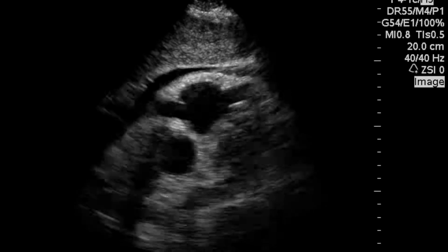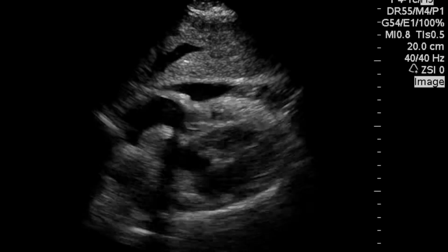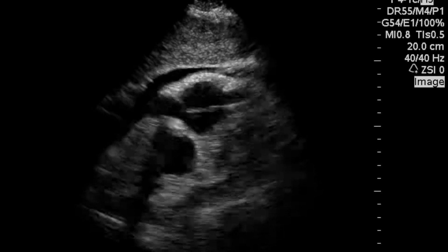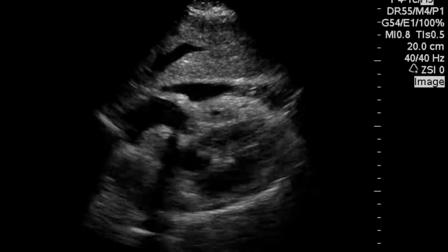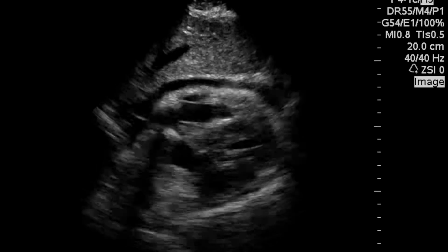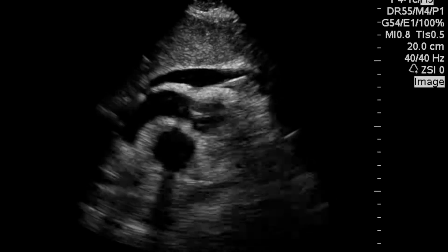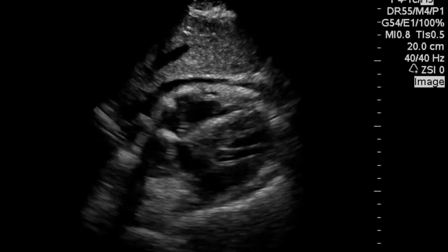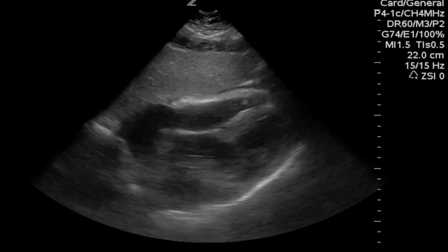It's got some tamponade features that we'll go over in later video lectures in the cardiac series. But for the trauma bay, in the acutely hypotensive traumatized patient, this is a positive FAST, and in the right setting leads to an ED thoracotomy to drain the fluid.